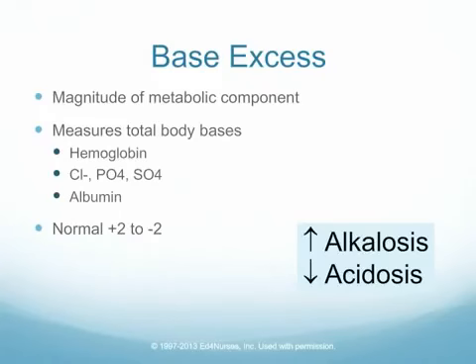The bigger the number gets, the more of an acid-base imbalance we have in our patient. And this tells you about the metabolic component. It doesn't tell you about respiratory. It tells you about what the metabolic component is doing.